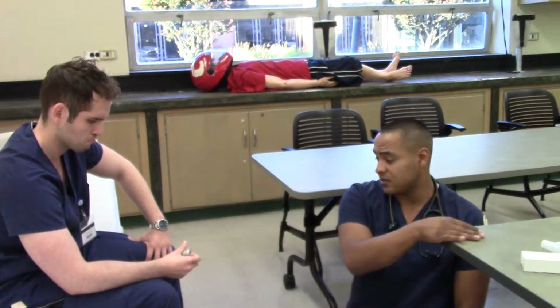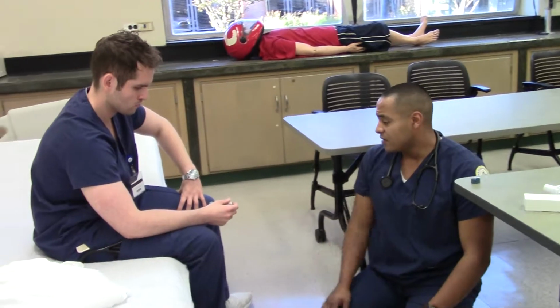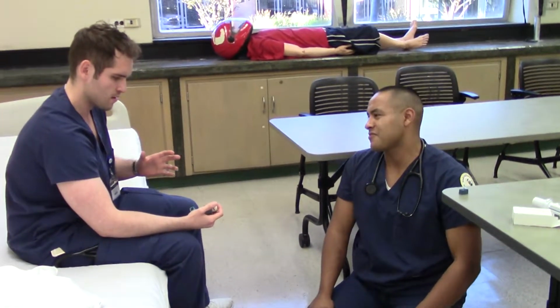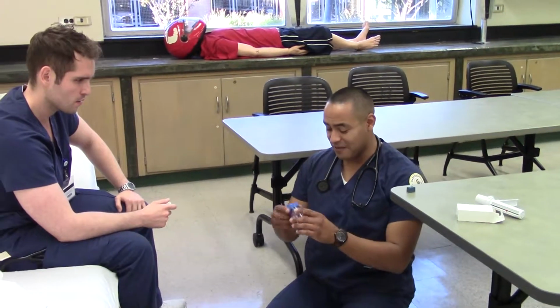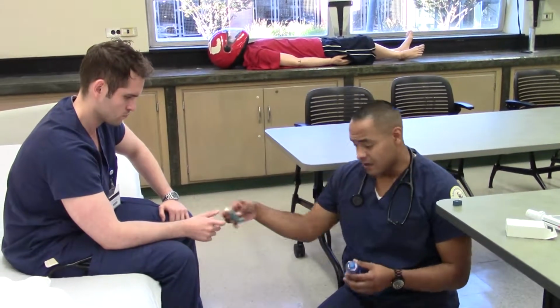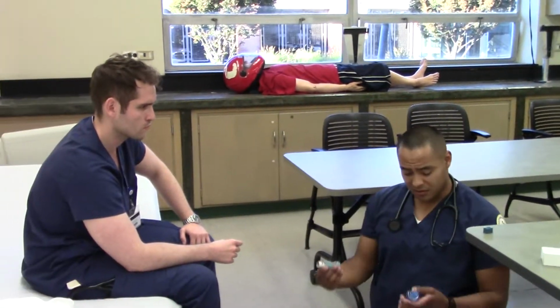Yeah, so this is it. And was it easy for you? It looked pretty good when you took it. I noticed there's another tool over there. Can you explain? Okay, sure. Yeah. This is a spacer. So what's good about this is when you take this normally without a spacer, you gotta push and breathe in at the same time, right?